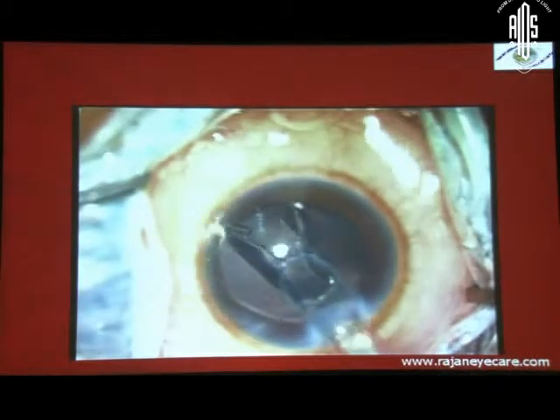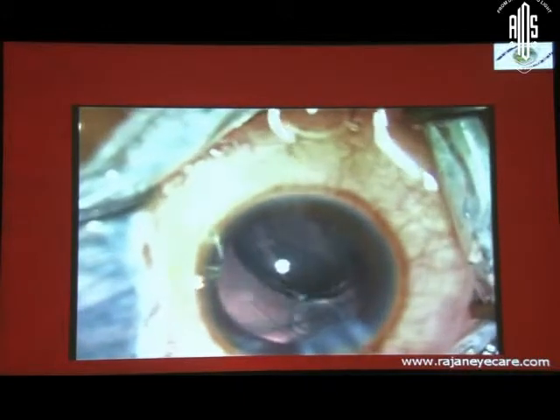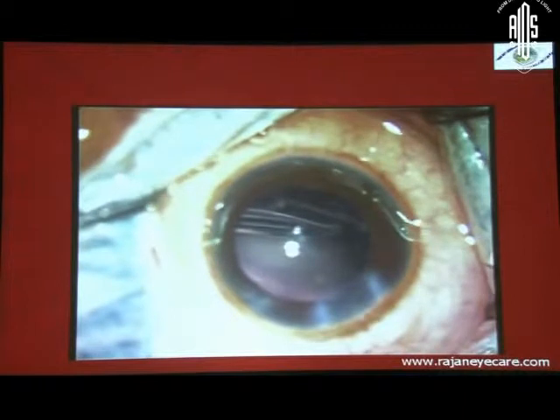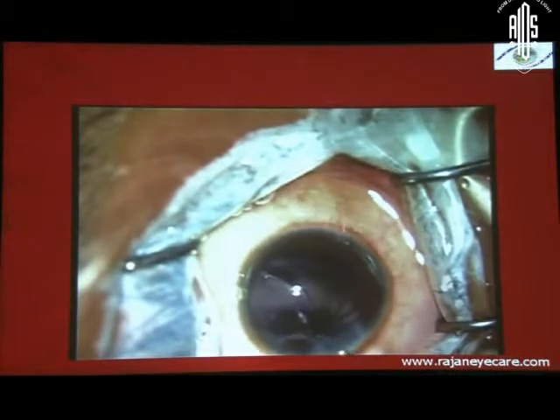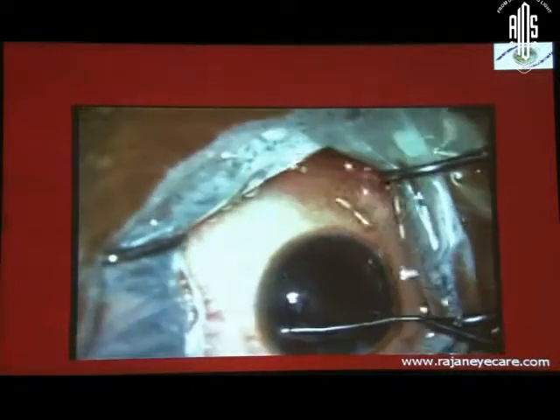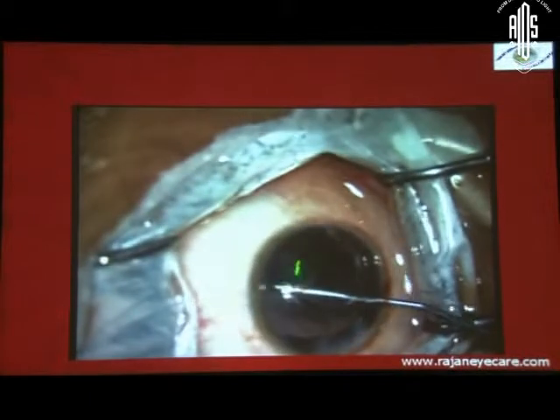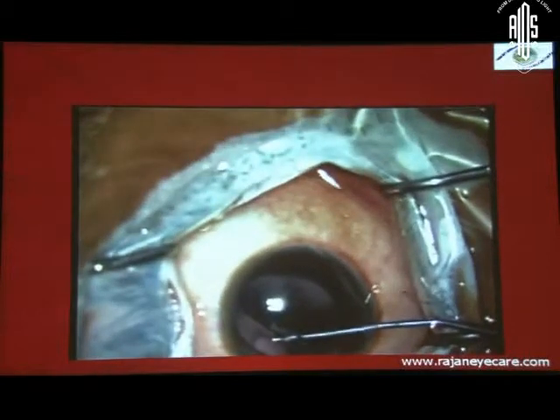But ideally, what you should do, look at this IOL. What has happened? When I injected the lens, in the last minute, it came with a jerk and produced a rupture in the PC. Now, the ideal way to retrieve this lens, to prevent the lens from going into the vitreous cavity, is to do what is called anterior assisted levitation. I take the haptic of the lens with the Kuglen or the Lester hook and try to bring that haptic up. Then I create a right side port, you can see there, and hold the lens at the junction of the haptic and the optic, and bring that entire lens up.